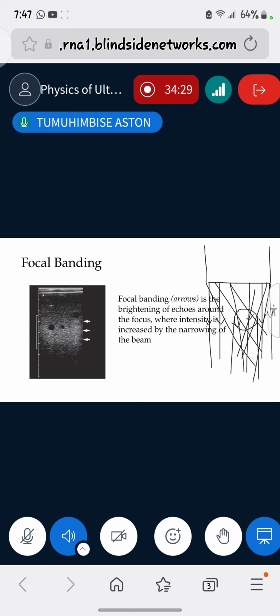Now, if there is spatial compounding, you said that the beams are sent in various directions, and won't they displace the shadow? Won't it disappear such that you as a sonographer are incapable of again identifying that particular structure because the shadow has been cast away?